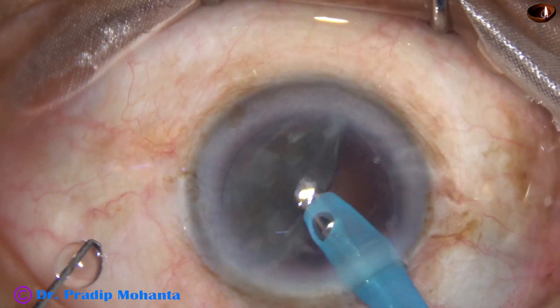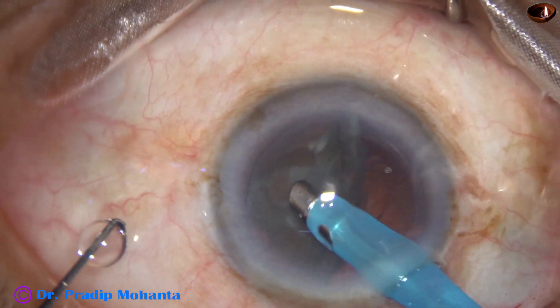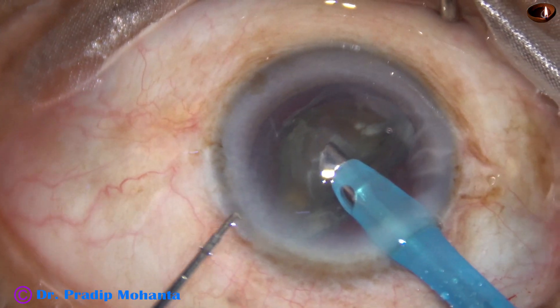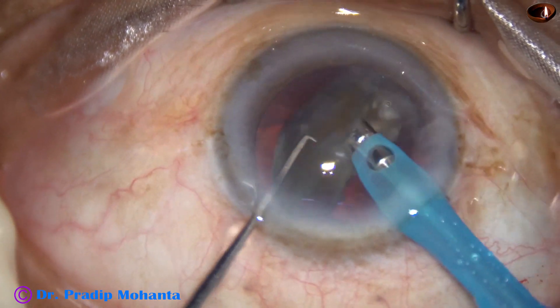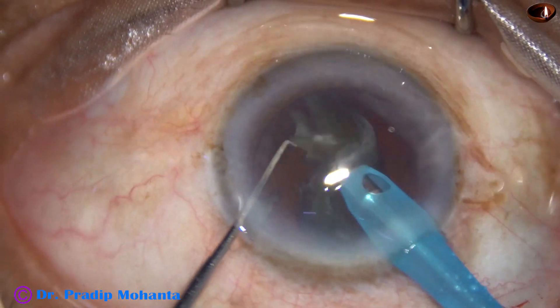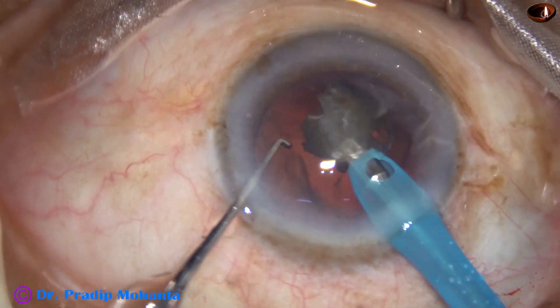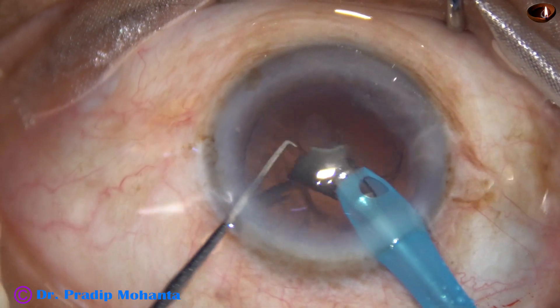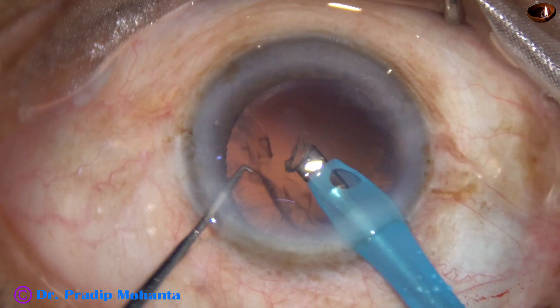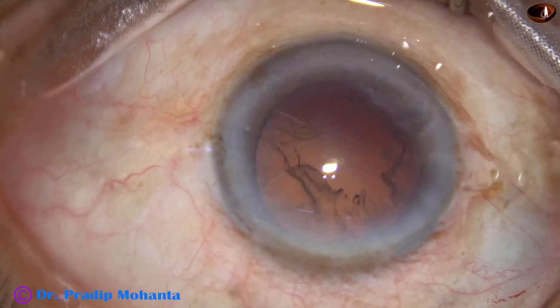At this time I usually go to phaco mode 3, where the vacuum is less — about 250 to 300 — and flow rate is 25 to 30 ml per minute. This is the last portion of the nucleus. We must take extra caution to manage the nucleus at this stage. The nucleus has been nicely managed and now the phaco needle is removed.